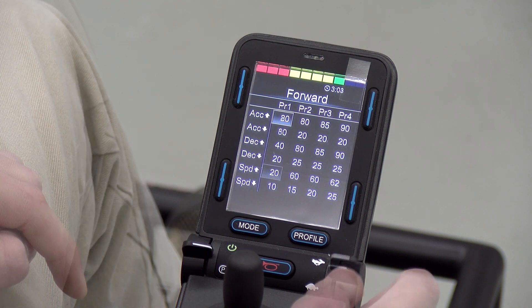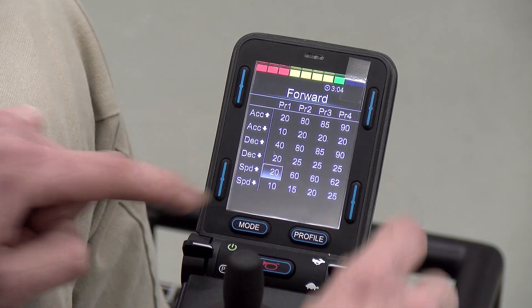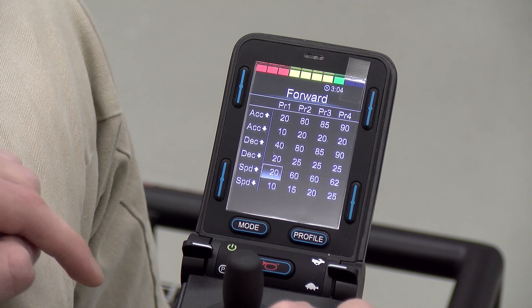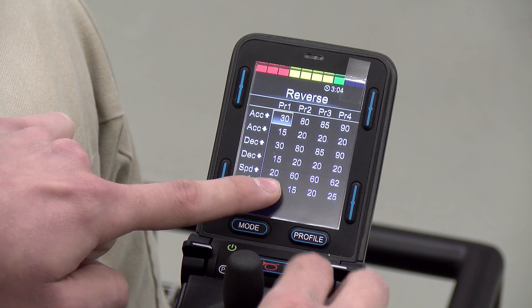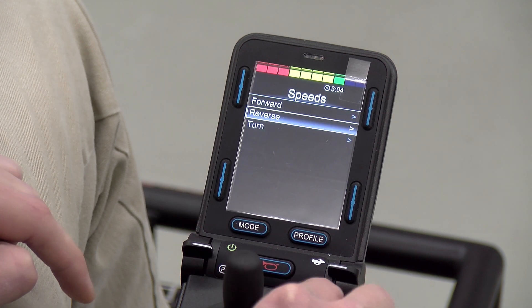Another common issue is forward and reverse speed. You can see the max forward speed is set to 20 and the minimum is set to 10, so we should be able to turn it down, but we're still not able to. This is because the reverse speed cannot be higher than the forward speed. So if we go into the reverse speed section we can turn down the maximum reverse speed, and now we should be able to turn down the maximum forward speed.